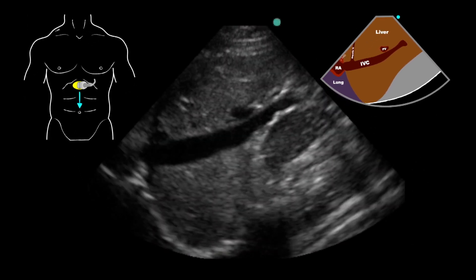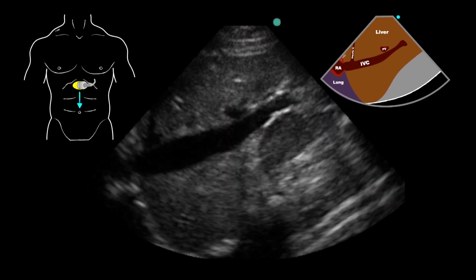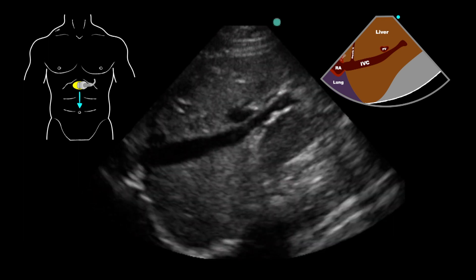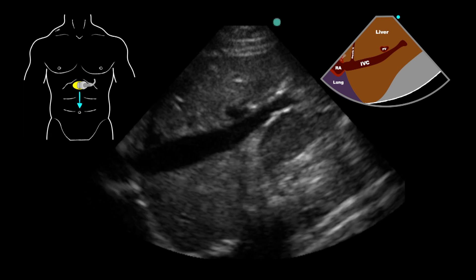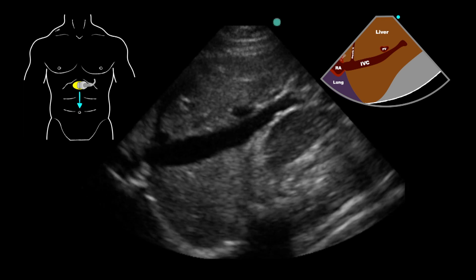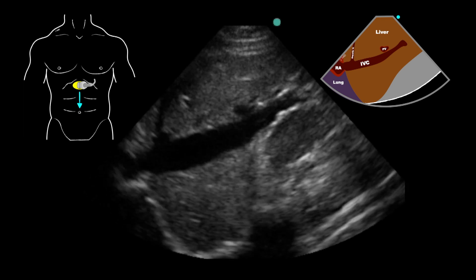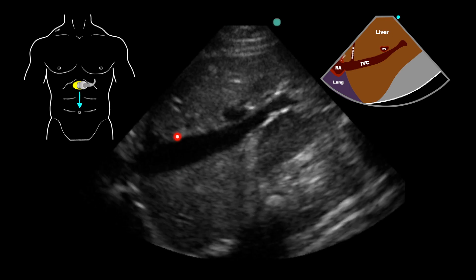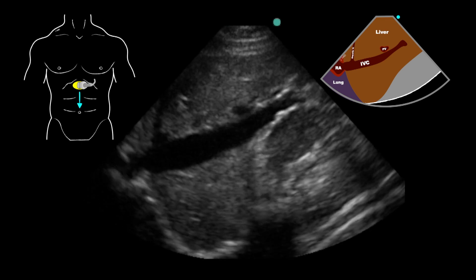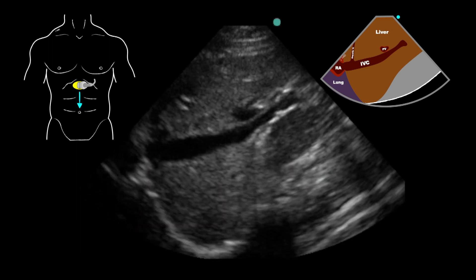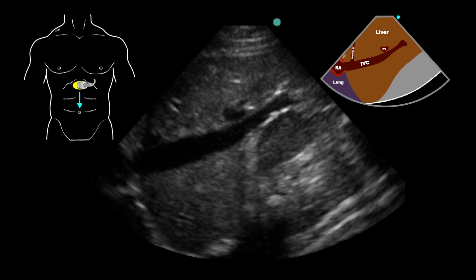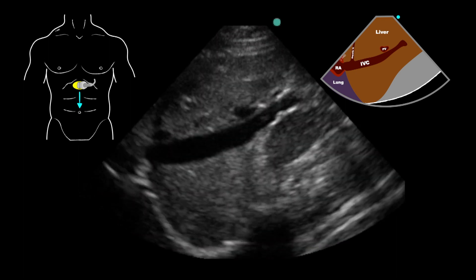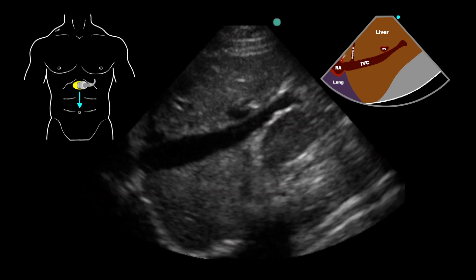In this view, we can watch the mobility of the IVC and see if it's compressible. What we're seeing right now is some variation with the emptying of the right heart, and we can also see some respiratory variation. By looking just distal to the hepatic vein in this area, we can see how much compressibility it has with inspiration. That variation can help us know the CVP, or central venous pressure.